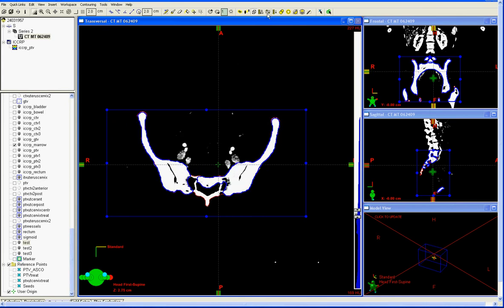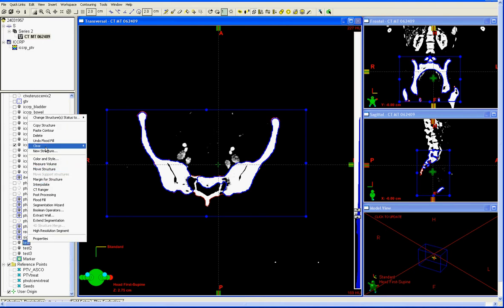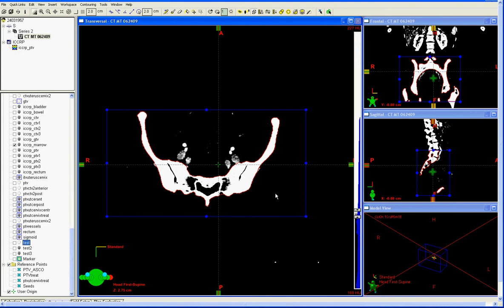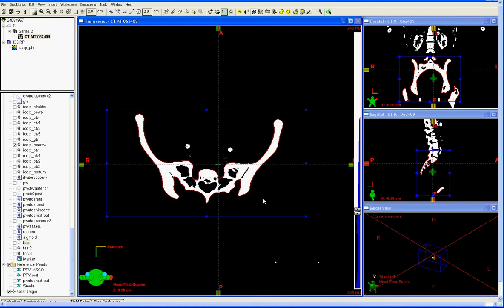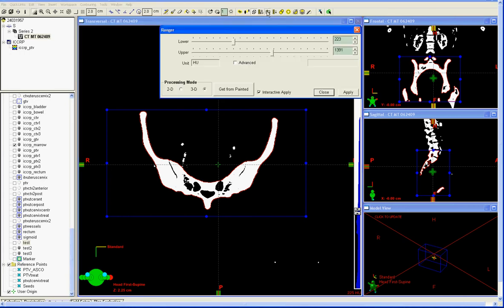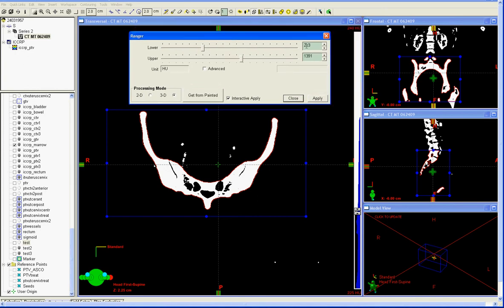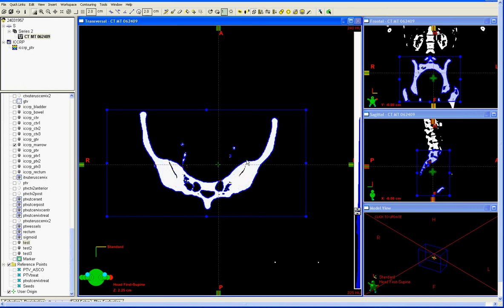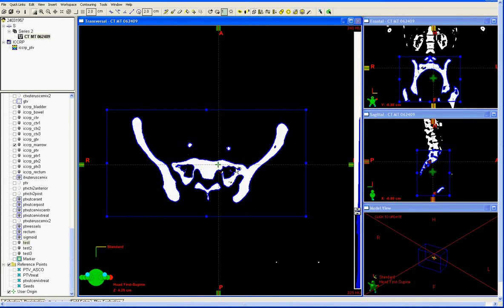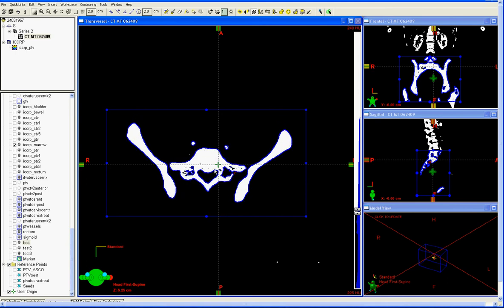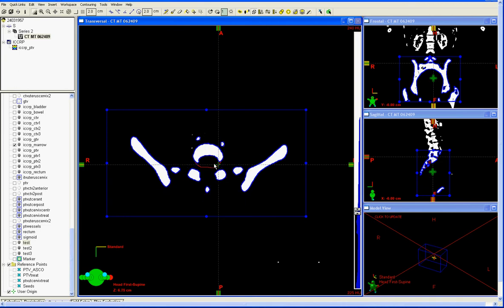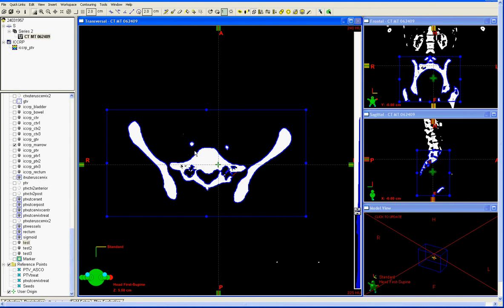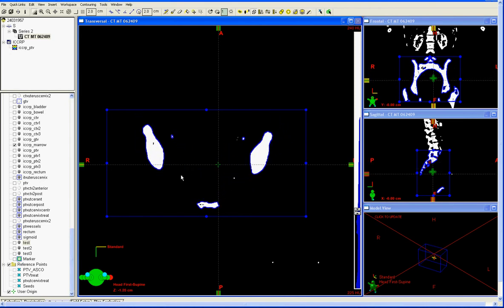A second approach is to use the CT Ranger function. We'll clear that and window a little bit more. We'll try using these settings with the CT Ranger function of about 220 on the lower order and 1400 on the upper, and click apply. That is useful as well for contouring the bone, and you can adjust the window and level settings. Some post-processing may be needed as this technique can pick up some contrast-enhanced vessels or calcifications, but for the most part it does a good job of quickly contouring the bone.